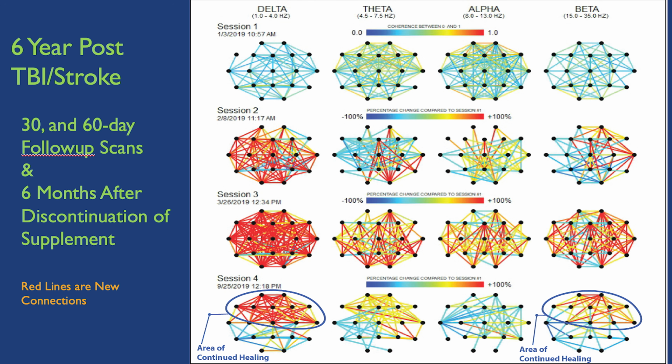And look, delta, this is why I think there's more going on than noise in delta. So you're seeing, I think, more repair work going on in the delta wavelength. So that's my 28-year-old. I think that's pretty impressive. Not only am I able to see reconnections, but I'm able to see where the damage was. The MRIs don't show you that. CAT scans don't show you that. So this opens up a whole new door. Now I've got a dependent variable that I can look at.